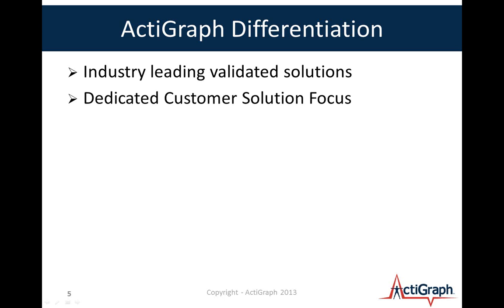But I think the key to make here with these first 2 points is that as a company, we've been involved in some really large-scale, multi-site, multi-year studies. Some of those include the European Youth Heart Study, over a 20-year period. The NHANES study, the National Health and Nutrition Examination Survey, with 13,000 subjects over a 3-year period. The TEDDY study, the Environmental Determinants of Diabetes in the Young, with 7,000 children followed over a 15-year period. The Harvard Women's Study, 15,000 women over about a 15-year period as well.